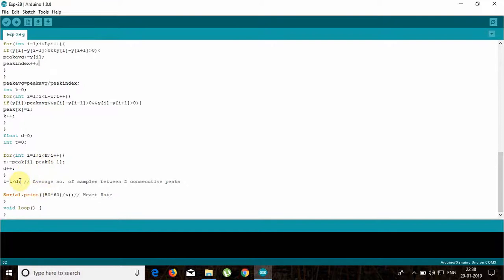The average number of samples between consecutive peaks is stored in this variable t, and as the sampling rate is 50 and the number of seconds in a minute is 60, we will calculate the heart rate with the help of this formula, and then we will print it.